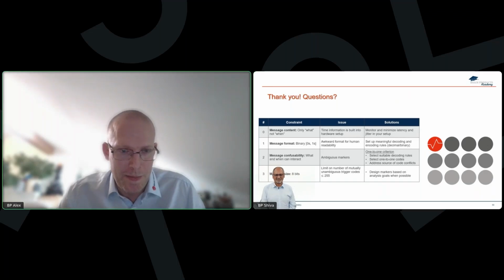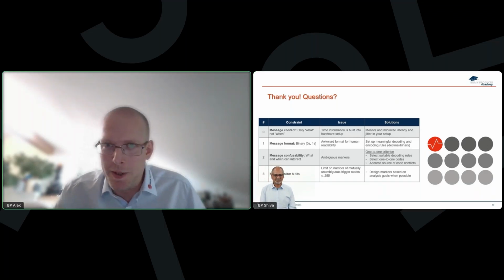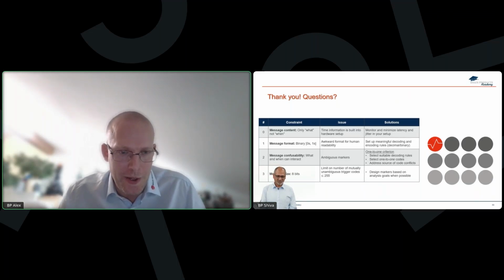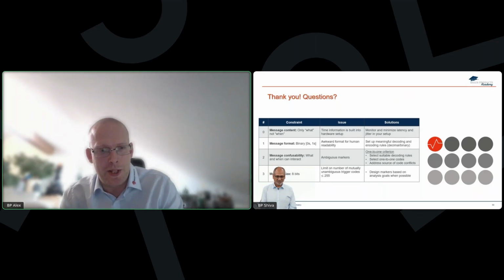Yeah, so basically, as I already answered as well, but I wanted to follow up, the delay caused by this interface is very low. In theory, it's below 1 millisecond, but it still depends on what kind of stimulus presentation software you are using. So there can be additional delays caused by synchronizing different events, and also, of course, synchronizing the events that are happening on the display and other things that are controlled by this stimulus presentation tool.